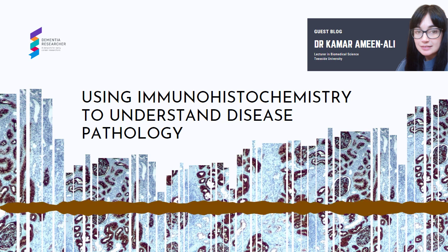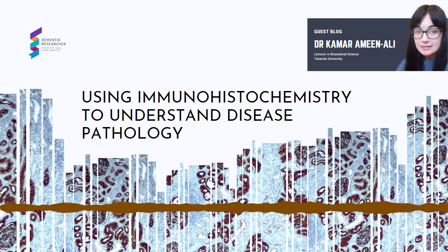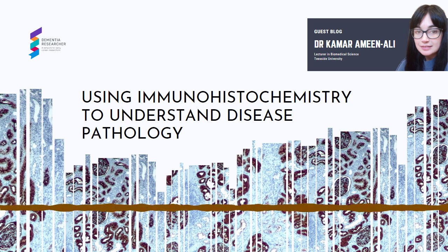Having a good working knowledge of immunohistochemical theory is also important because there will inevitably be a degree of troubleshooting required for any scientist doing pathology. This will primarily be part of the process of optimization if you have a new antibody you want to use for the first time in your lab, so you have no established protocol for it. But sometimes, often for no apparent reason, your staining fails to work. You may fail to get any staining, or you may have too much background staining, and this can even be when you've used the protocol before and no conditions have been changed.